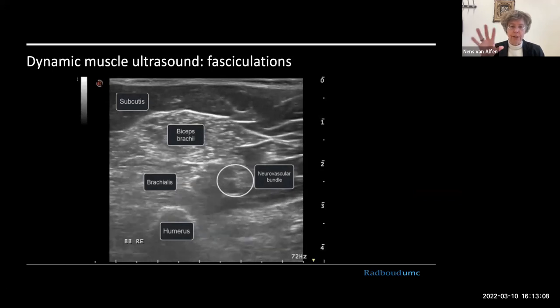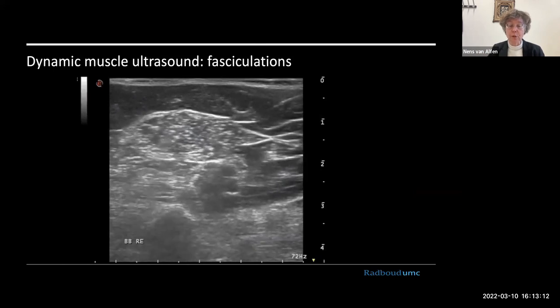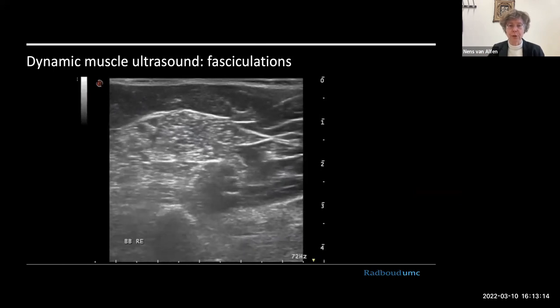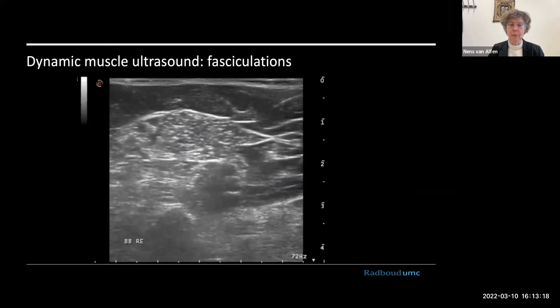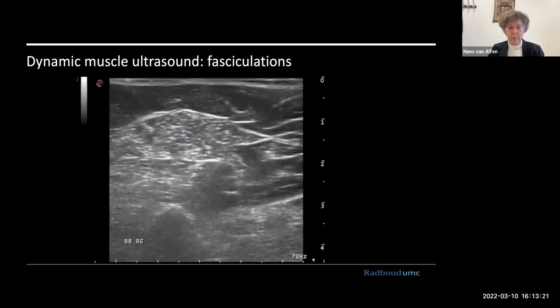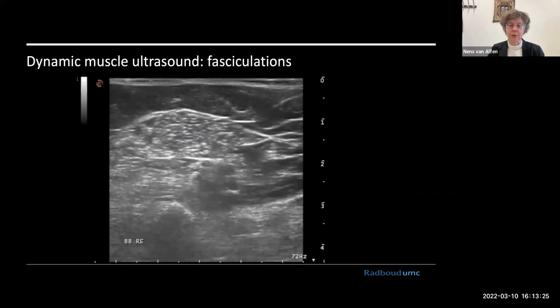And you see all these tiny jerky movements going on in these muscle tissues, and you can't predict them. You don't know where the next one's going to be or when. Now that's very typical for fasciculations. It's a chunk of muscle and it's random. So this will go on for a very long time, as long as the video plays. And this is a patient with ALS in the diagnostic phase.